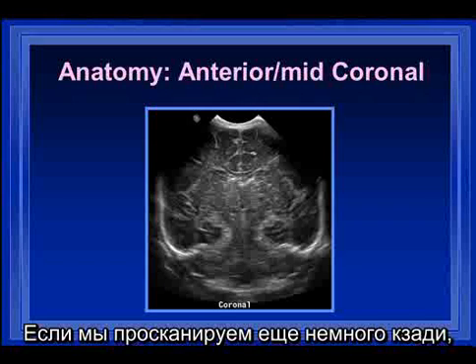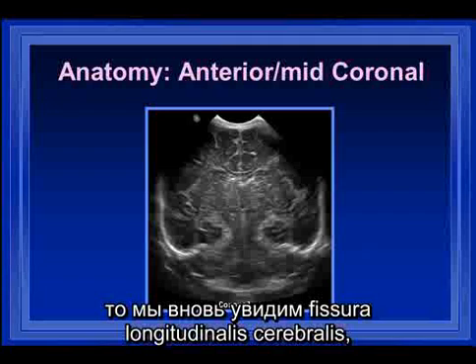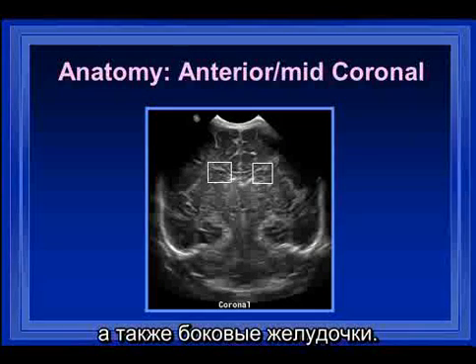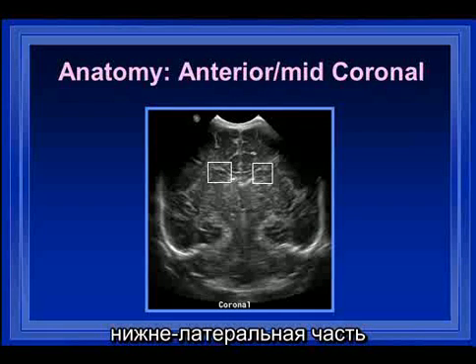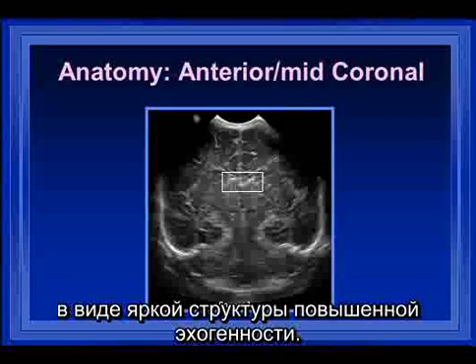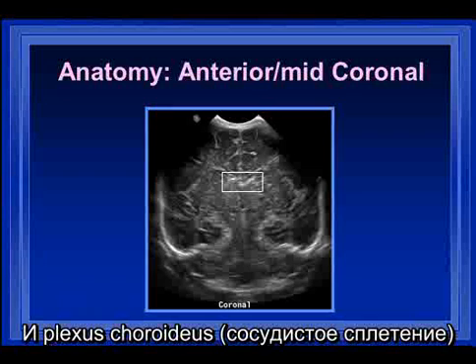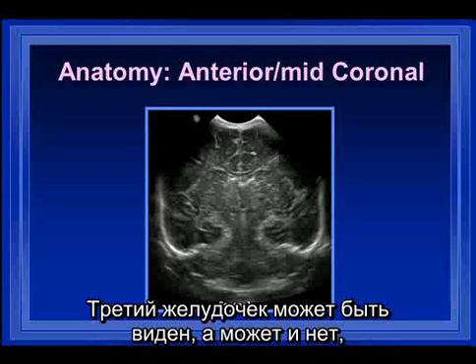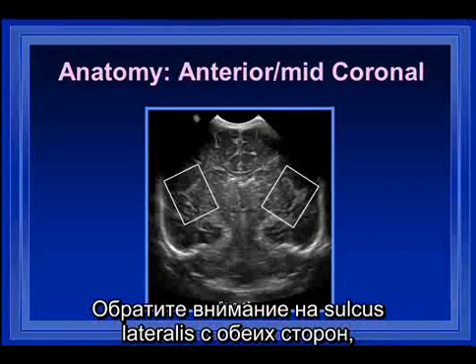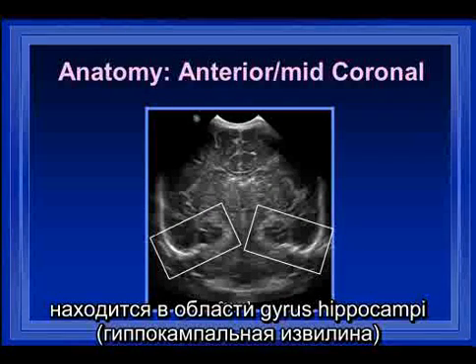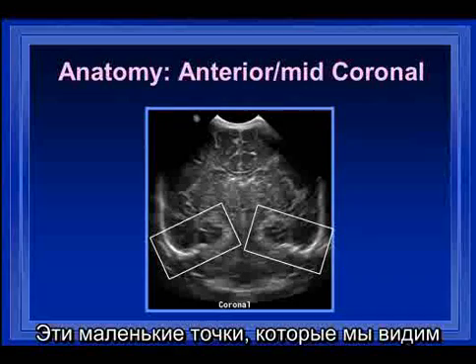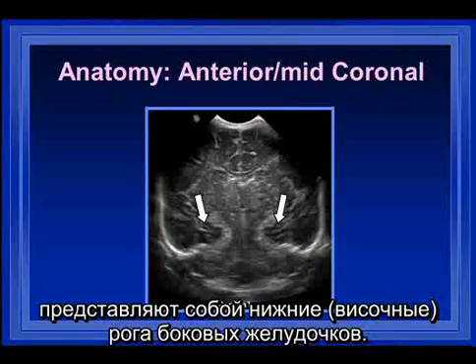Coming back a little more posteriorly to the anterior mid-coronal view, we again see the interhemispheric fissure with the cingulate gyri. We can see the corpus callosum and image the lateral ventricles. Note that the inferior lateral aspect of the frontal horns is concave, and we can see the choroid plexus as brighter areas of echogenicity going through the foramina of Monroe and in the region of the roof of the third ventricle. Note the sylvian fissures bilaterally and the bright echogenicity in the region of the hippocampal gyrus. The small dots seen centrally in the temporal lobe represent the temporal horns.